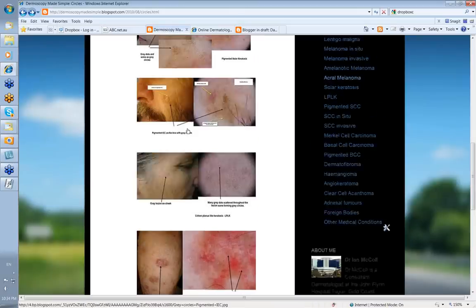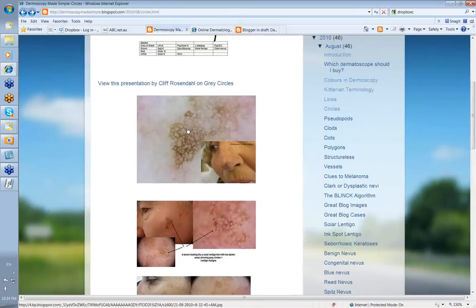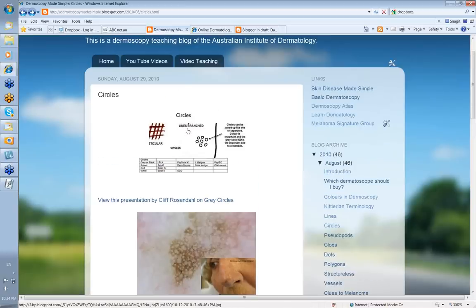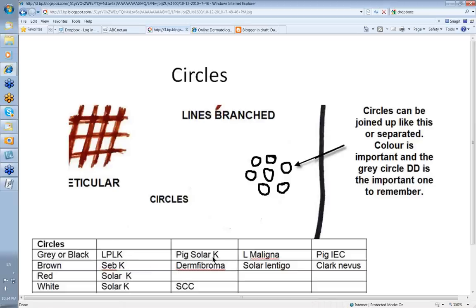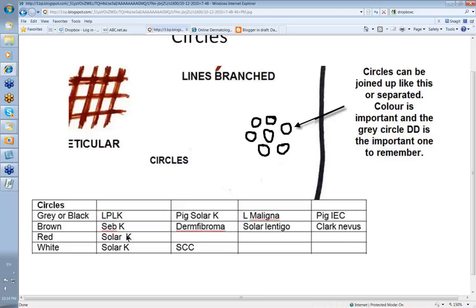This has just been a quick overview of circles. It's the grey or black circles on the face that are going to be the important ones for your differential diagnosis: LPLK, pigmented solar keratosis, pigmented IEC, or lentigo maligna. Your brown circles can be seen in seborrheic keratosis, dermatofibroma, solar lentigo, or Clark nevus. The red ones and white ones can be seen in both solar keratosis and SCC. Remember the grey or black ones. Thank you very much.